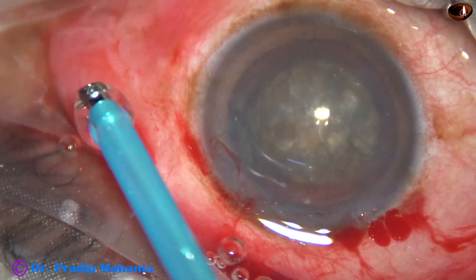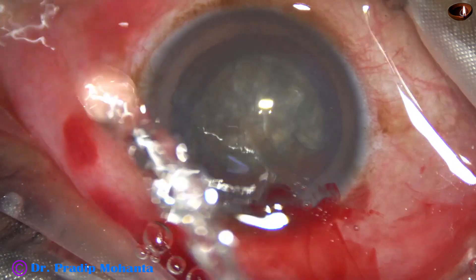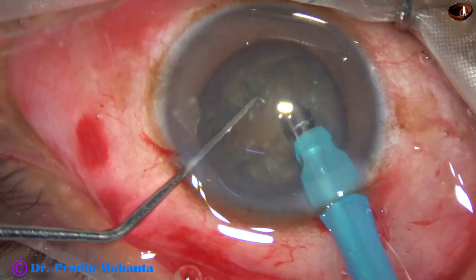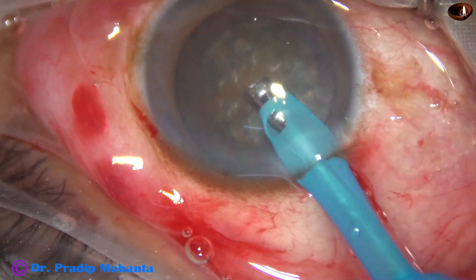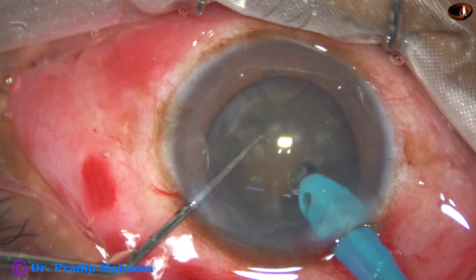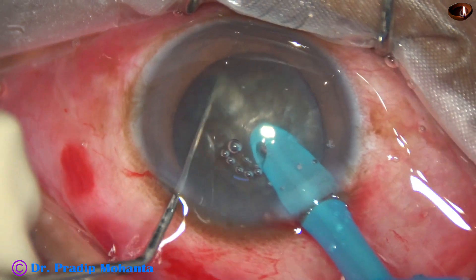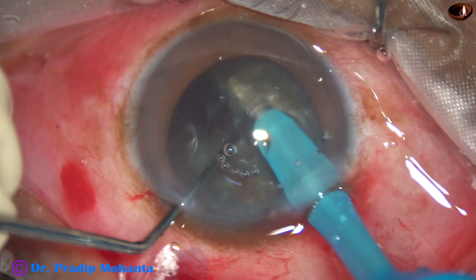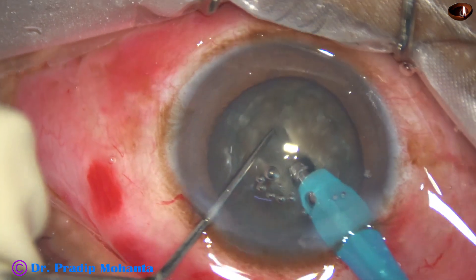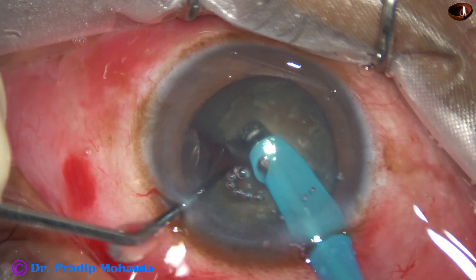Now is the time to introduce the phaco needle. The exposed part of the phaco needle is a little more than in other cases. Enter into the anterior chamber with bevel down and aspirate some cortex. The tip is buried into the substance of the nucleus — we must not push the nucleus; the nuclear position should remain the same. The phaco needle will cut the matter in front and move. A very nice crack has been obtained. Now rotate 180 degrees, come to the other side, go to a deeper plane, support the hemi-nucleus and separate the two hemi-nuclei completely.